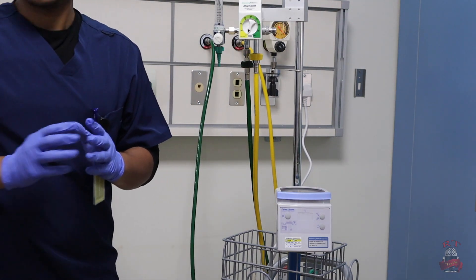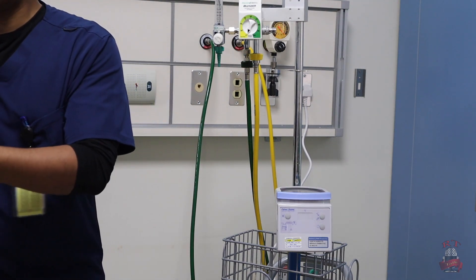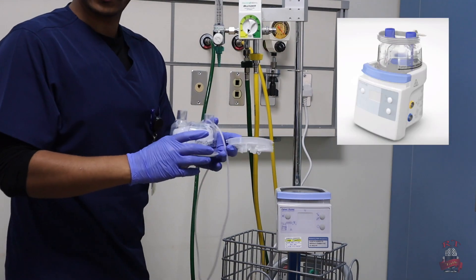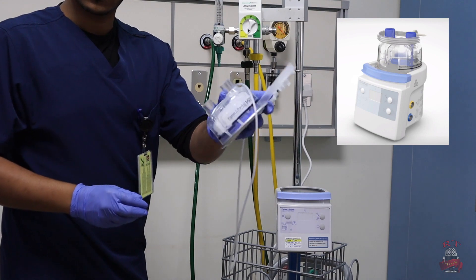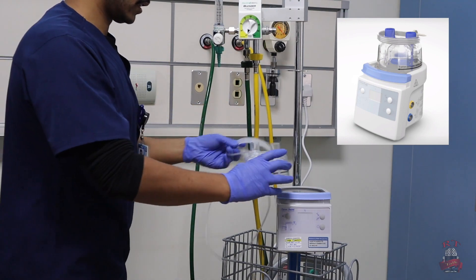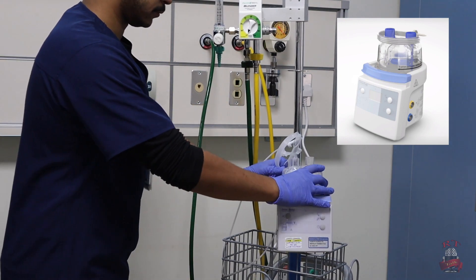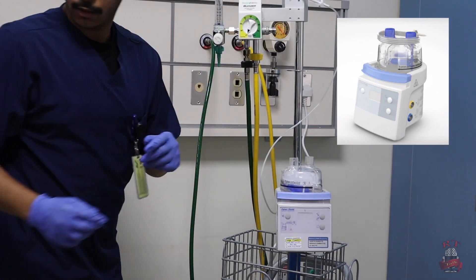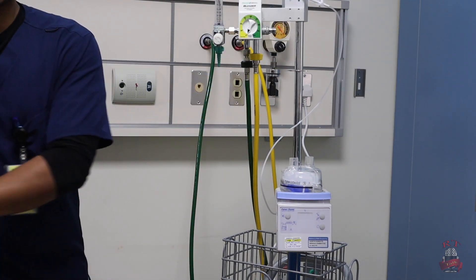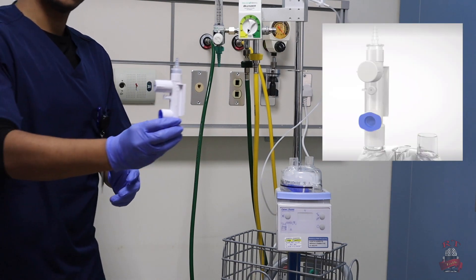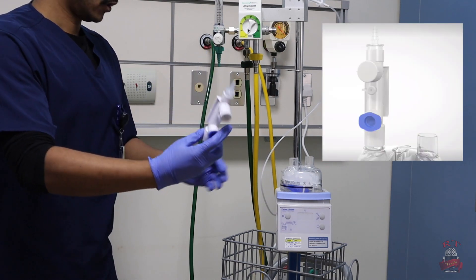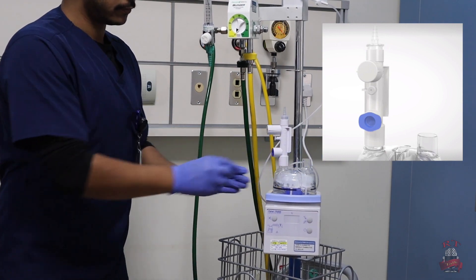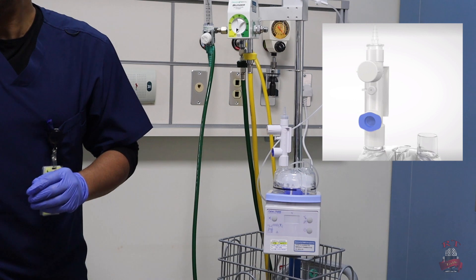After that, you will take your humidifier chamber from your bubble CPAP system kit, this one. You will insert it in the humidifier. Then you will take your pressure release valve, this one. You will put it on one side of your humidifier chamber.